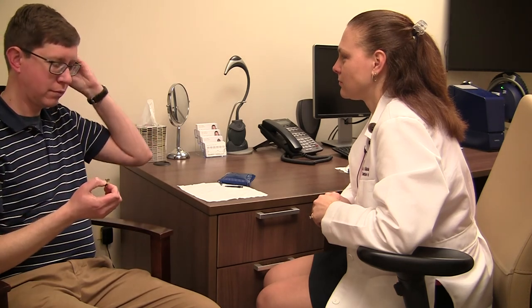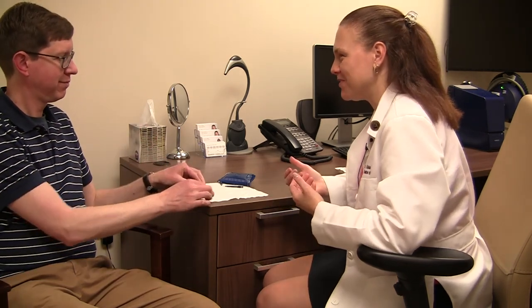Try the right side. Reach up and give them a good push — not going to go too far. Now take them out. Great, it's like you've worn them before!